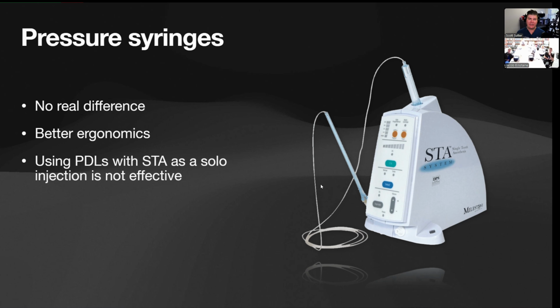The one thing about it is it's pretty expensive. It's about $10 for all of the disposables per patient. So that adds quite a lot, and that doesn't include the cost of the anesthetic or the needle. So you are adding quite a lot of cost to seeing a patient, but if it's going to let you keep practicing and not have carpal tunnel, it's worth it. They have found multiple times that there's a lot of people who be like, oh, just use PDLs instead of having to do the IA, because everyone's afraid of doing the IA. It doesn't work.